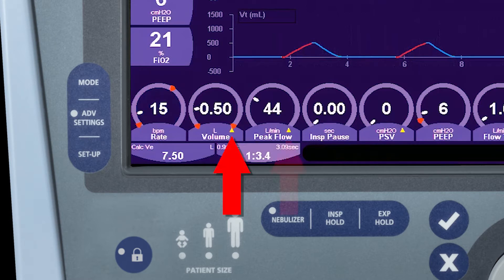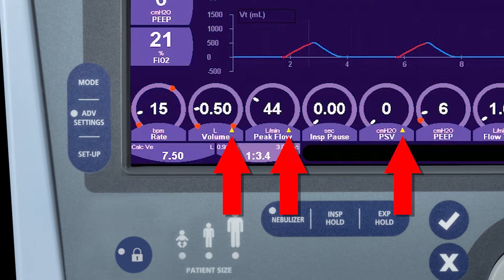Some of the controls you may notice have an upward-pointing yellow triangle. This means that there are advanced settings associated with those specific controls.